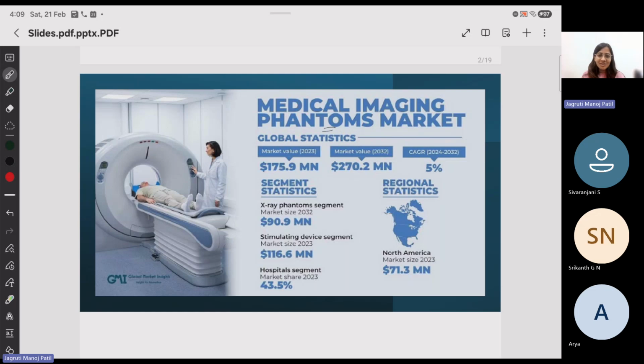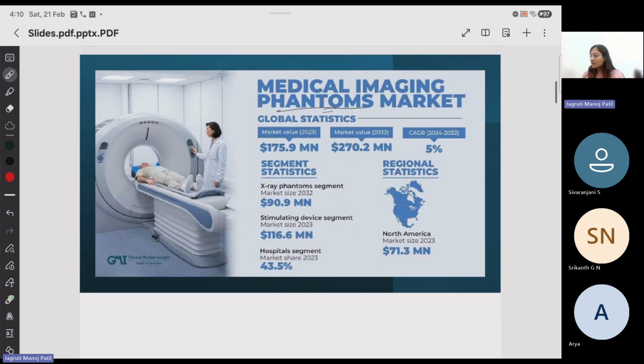Phantoms here don't mean ghosts. They mimic our own tissue, with similar acoustic and viscoelastic mechanical properties, so that we can validate imaging algorithms, modalities and principles first on them, then in small animal models, then in ex vivo human tissues, and finally in vivo in humans. That market is also predominantly increasing.